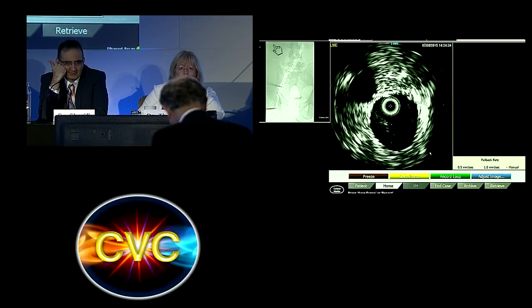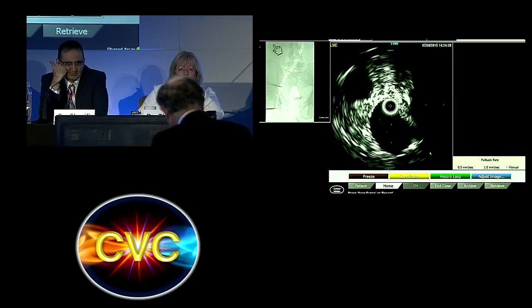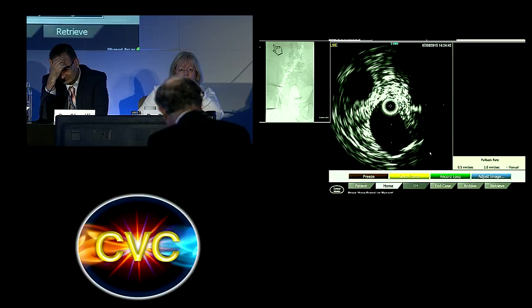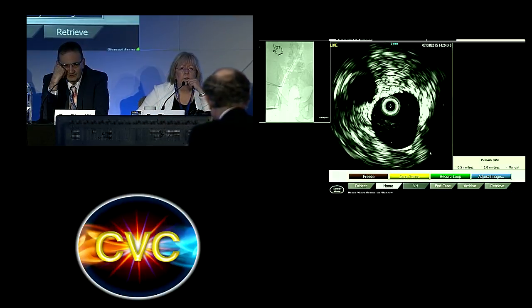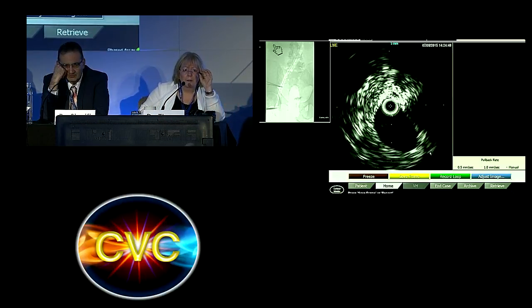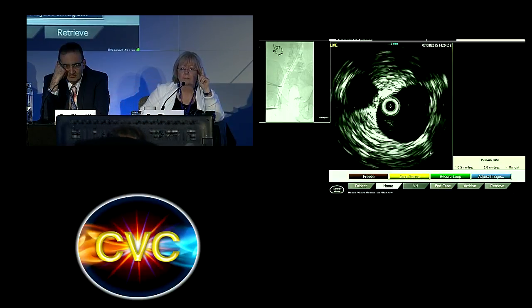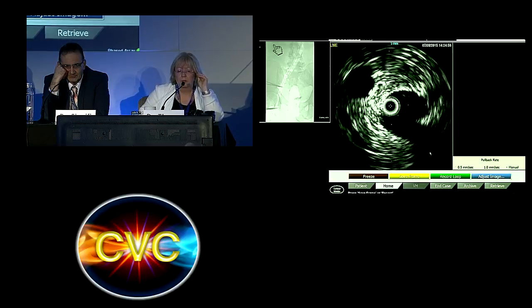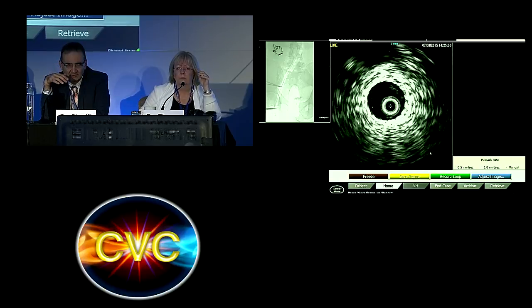I don't have any objection to putting another stent in, but I just wonder if some of this slower flow is just this very large patient in prone position with a lot of pressure on his belly. Yeah. Usually that doesn't explain the stasis of flow. I mean, the stasis is a bad sign. To a good result, you shouldn't have that. It's like a collateral that keeps showing up.